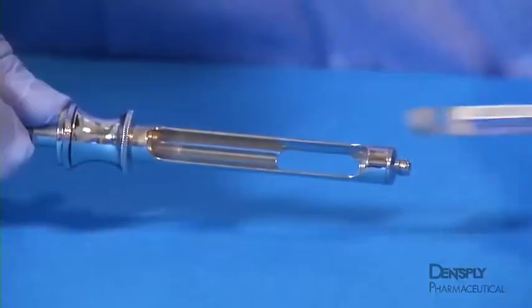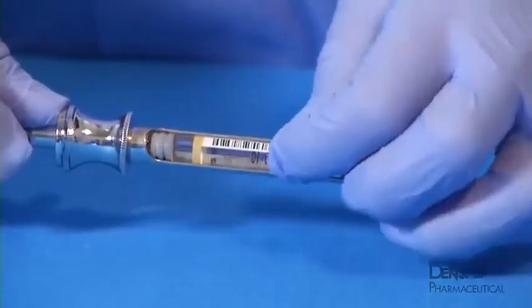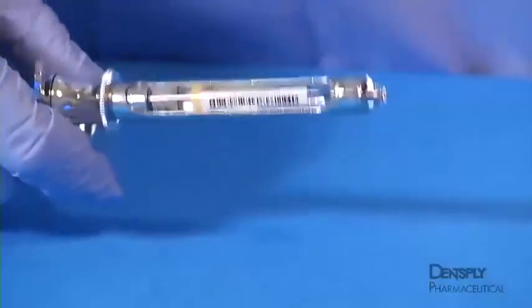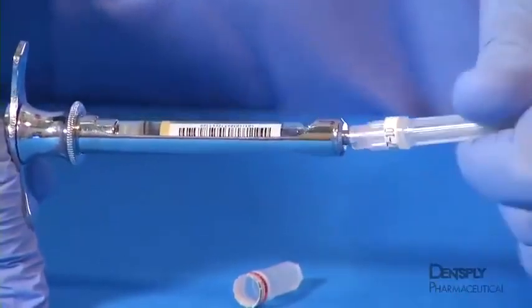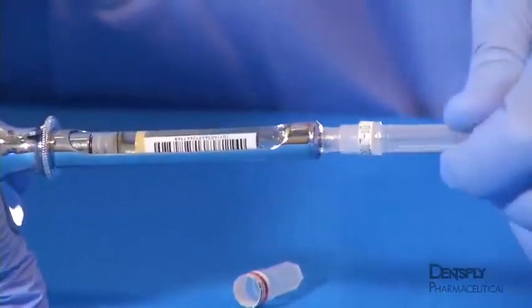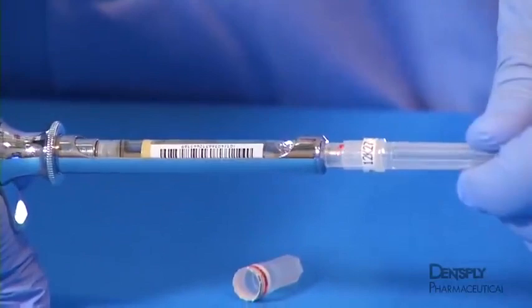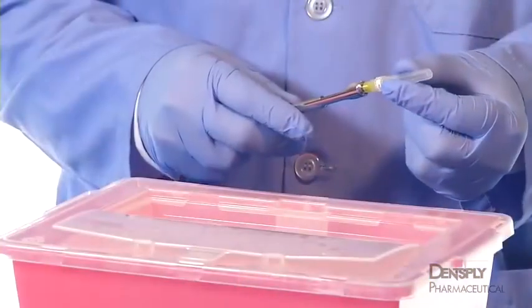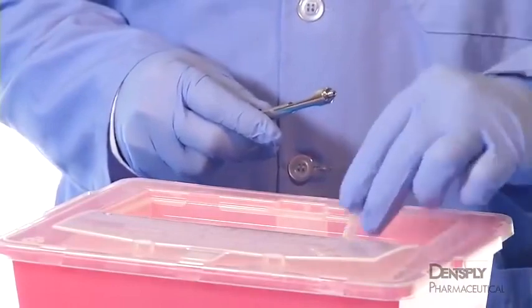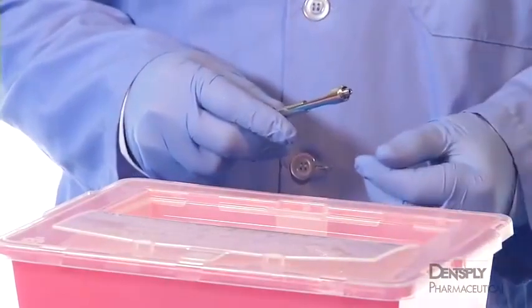When used correctly, the sterile single-dose cartridge, disposable hypodermic needle, sharps, and sterile aspirating syringe combine to ensure accurate placement of the local anesthetic solution with minimal risk to the patient. Proper handling and disposing of contaminated needles are important issues in the practice of local anesthesia.